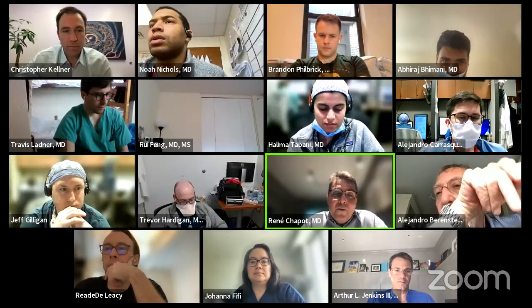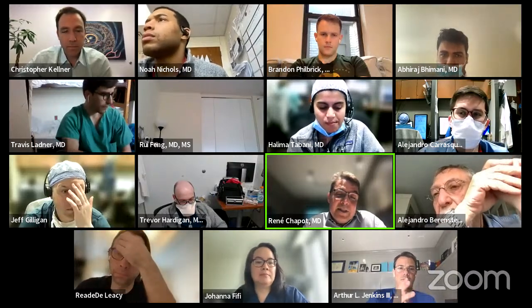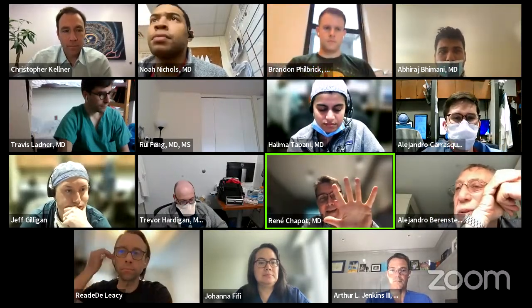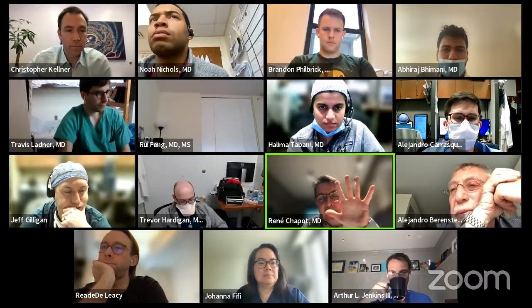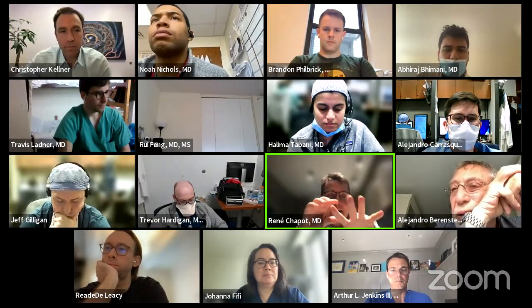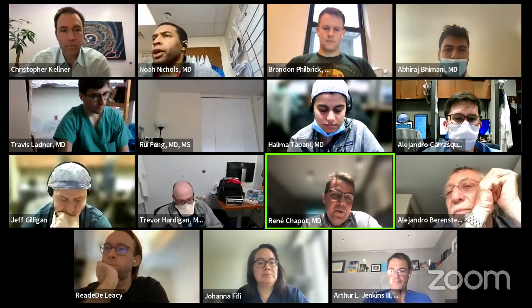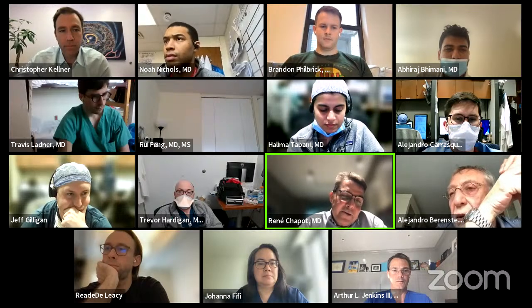Definitely venous is not always the only thing. It's a combination of things, first transarterial in order to reduce it as much as possible, and then trying to understand the veins. If here, my hand is a venous segmentation with a main vein and different primary veins arriving, the whole point is to find veins that can be identified in isolation, so that each vein can be occluded, so that the AVM can be occluded step by step. If we need to do a lot within one step, it is more dangerous.